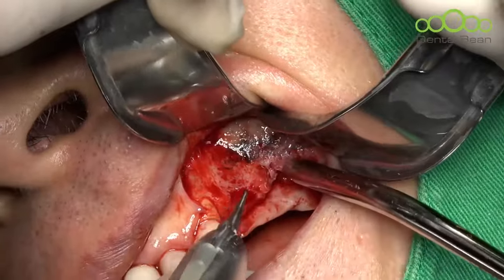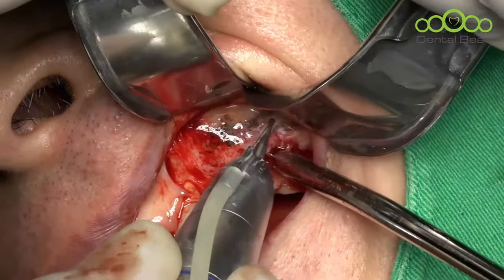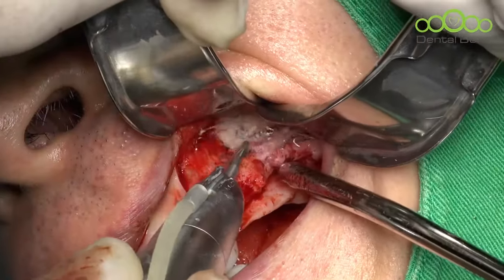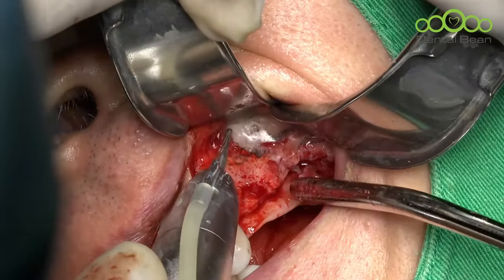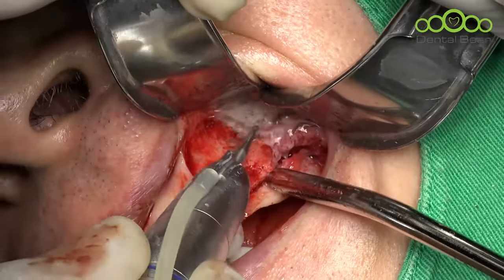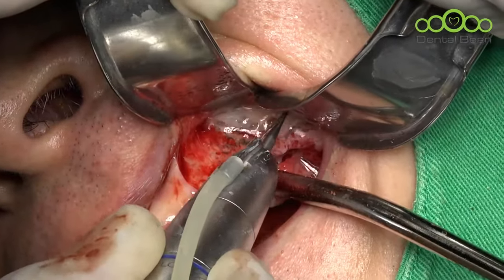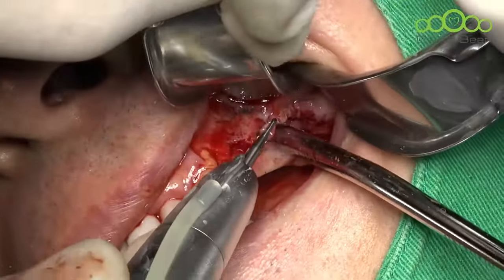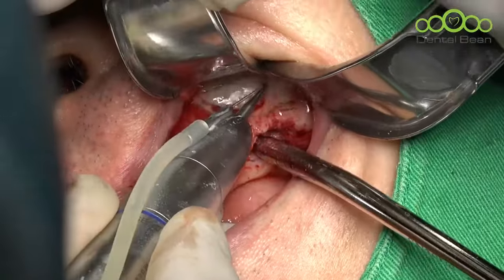Let's go on to the window. Hold on. I'll scope on the window. Okay. I'm using a small sized round bar. My favorite size is number 2 sized round bar. But this is too small for a beginner. I recommend you use number 4 or number 6 sized round bar.